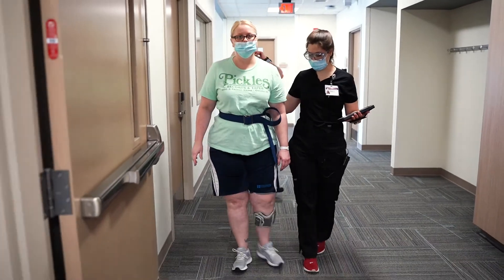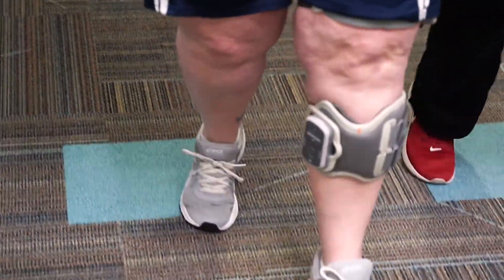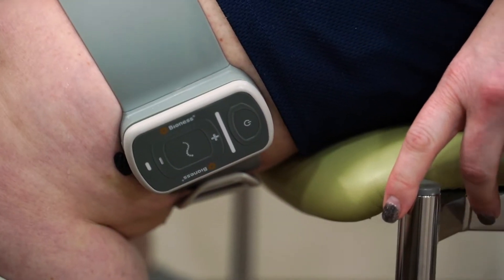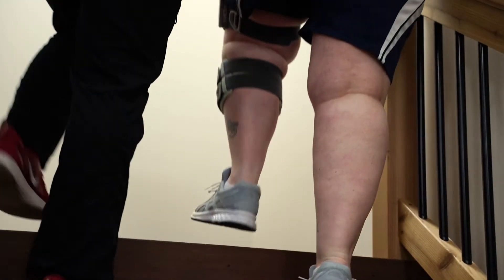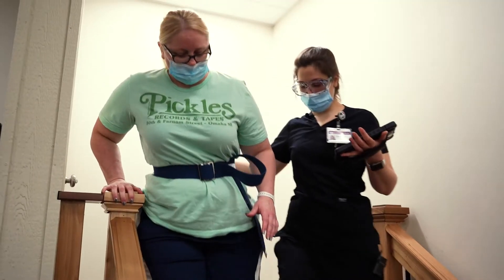It makes you think — every time you feel that shock, it makes your muscle contract and it kind of moves your leg how it's supposed to move, and then your brain can kind of connect with that and say, oh, that's right. And then when you're walking even after that, it's something that you're thinking about a little bit more.